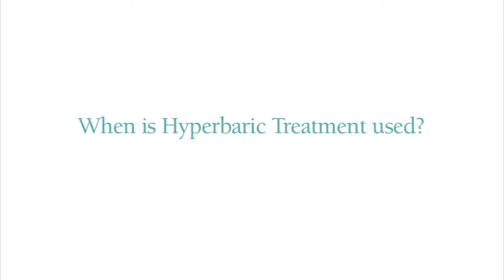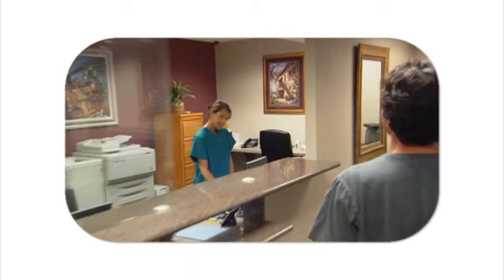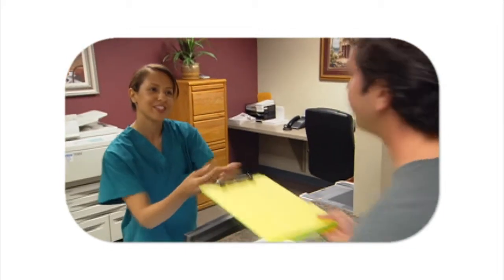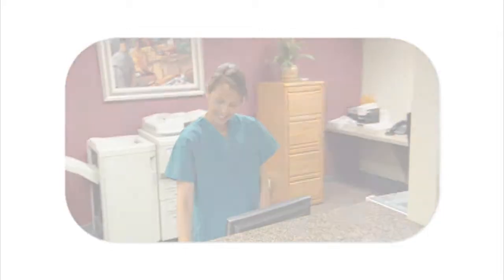A patient will, generally speaking, be referred to our center, and about 15% of the time we'll find that hyperbaric oxygen treatment will benefit the wound. And we know that those types of wounds, for instance, that are positively impacted with the usage of the hyperbaric chamber include certain types of diabetic lower extremity wounds.